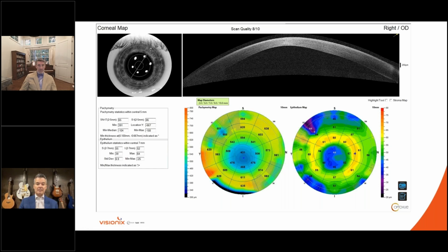And what you can see in these individuals or these patients is we oftentimes forget that keratoconus in and of itself is a corneal thinning condition that manifests as ectasia, but ultimately, this is a corneal thinning condition that results in ectasia. And you can see that here where the cornea is thinning, and that's denoted by the darker blue colors.